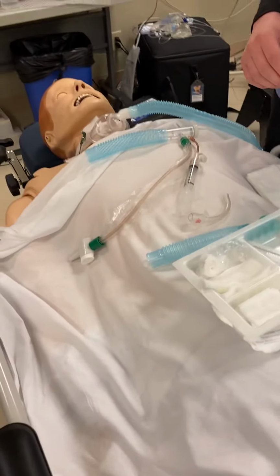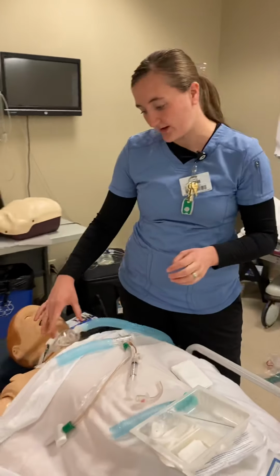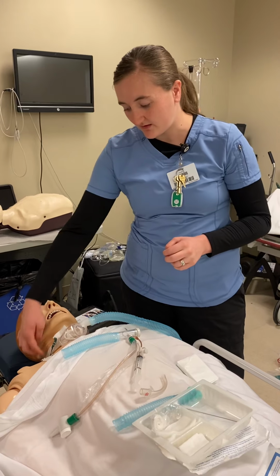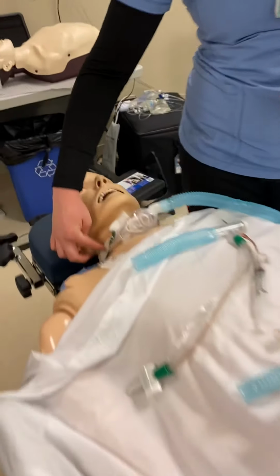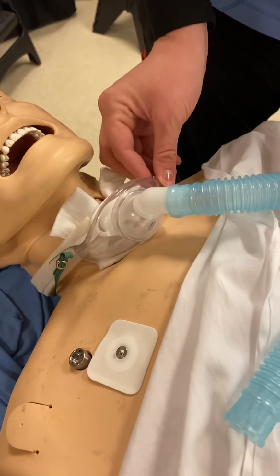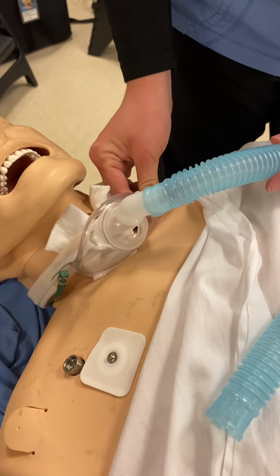So when you are doing trach care, that means you're going to replace the dressing on your trach. You're going to change out the ties on your trach if they are soiled, and then you're going to replace the intercannula. This is a trach mask. This is what it would look like if your patient was on trach mask.